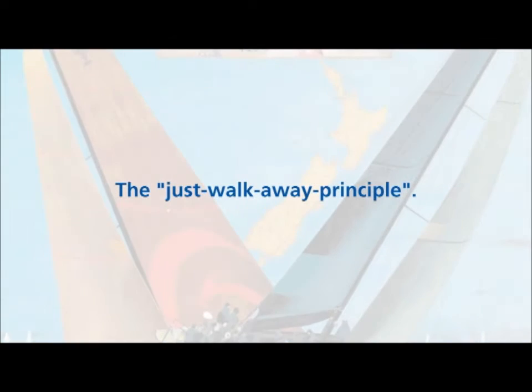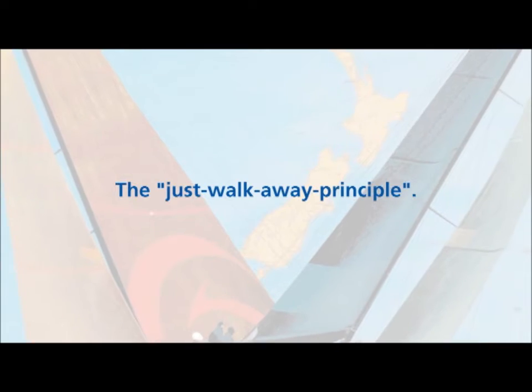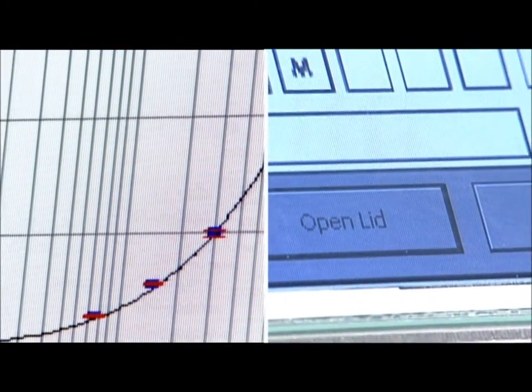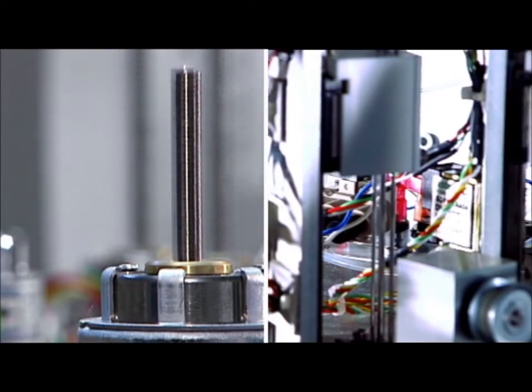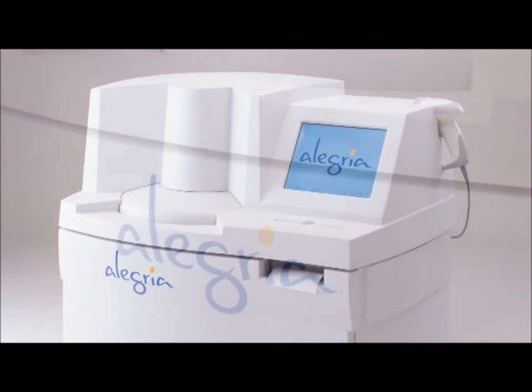The principle is as simple as can be. That's why it's called the just walk away principle. Here are a few of the special features for customers who are operating labs all over the world. Allegria achieves absolutely stable results, because it operates under constant test conditions. These conditions include exact adherence to temperature.